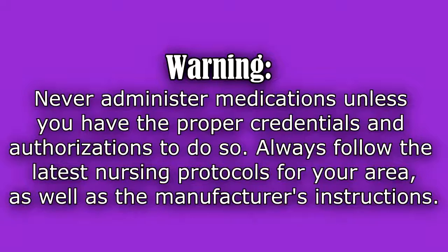Also, never administer medications to a patient if you don't have proper credentials or if you've not been trained, and always follow your hospital protocols. Another thing, whenever you're going to prime it, you want to check the expiration date, but you also want to make sure that there's enough doses in this inhaler, because they only contain so many puffs. A lot of inhalers have a counter on them and it'll tell you how many are left, like 20, 10, however many. So look there to make sure you have enough.